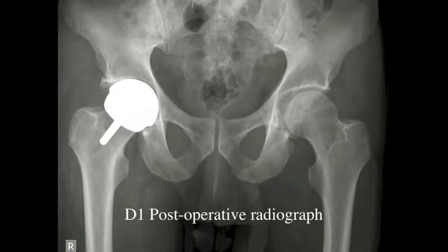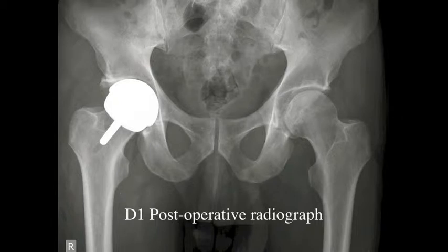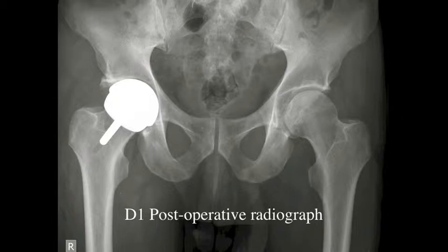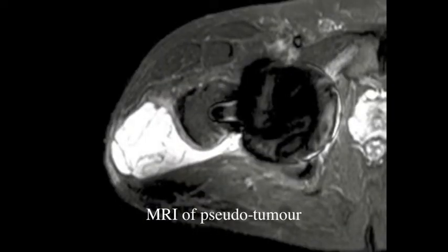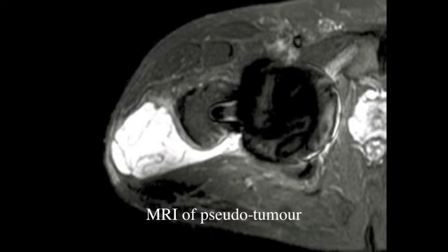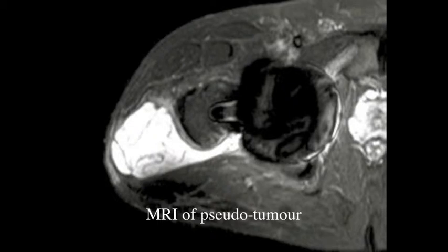This patient presents with persistent swelling about the hip after resurfacing arthroplasty. MRI demonstrates a fluid collection communicating with the joint posterior to the greater trochanter.